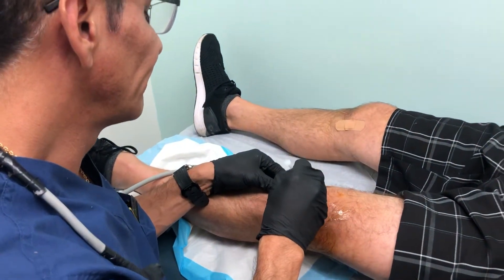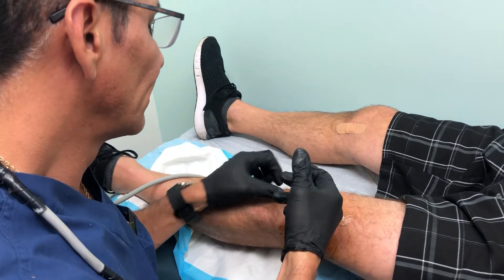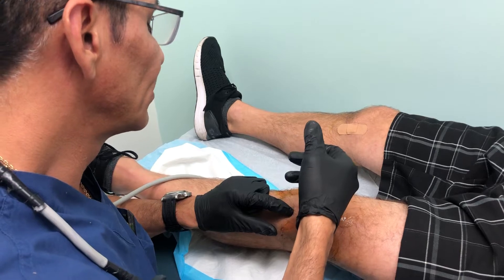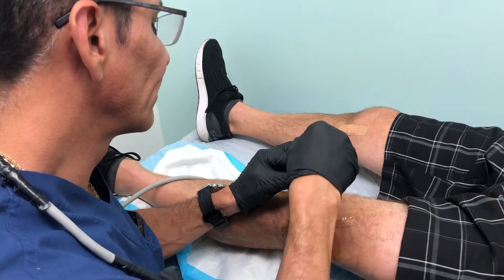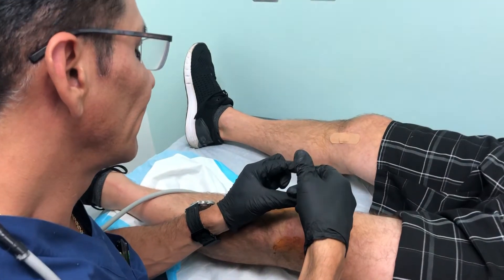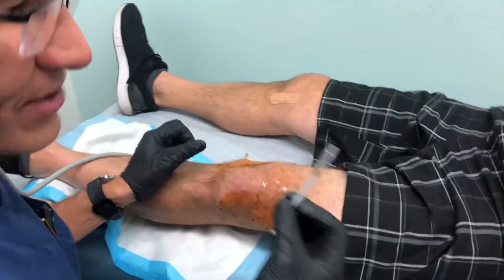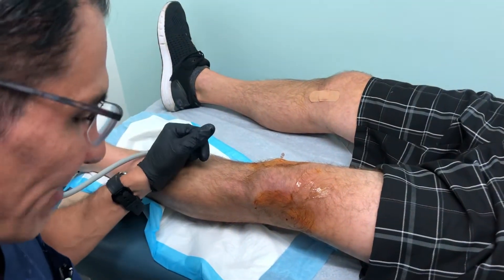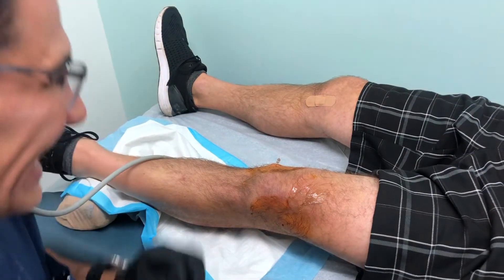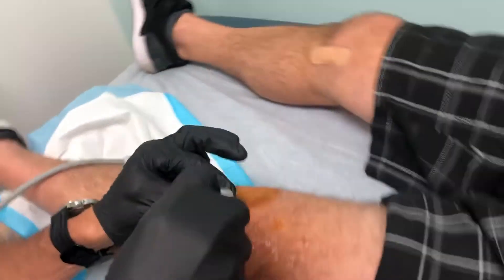You okay so far, Steve? I'm numbing you up a little bit more. I know it burns a little bit. I'll make sure I'm in line with the joint. I go a little bit deeper — make sure we're okay, a little deeper. What I'm going to do is a little trick I learned. Just kidding around, trying to be funny here.